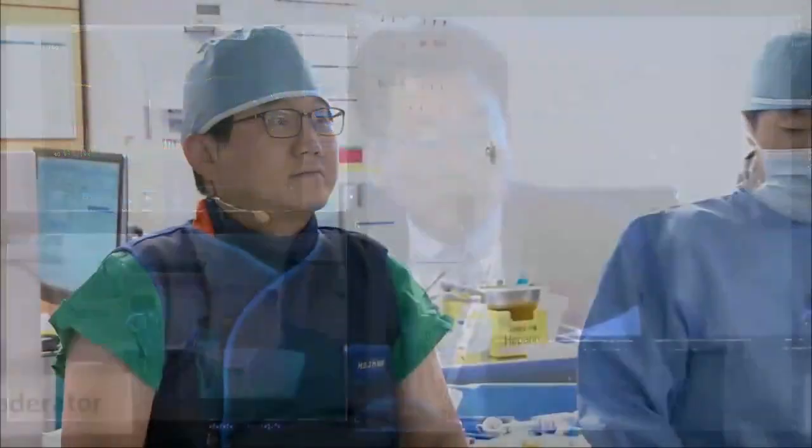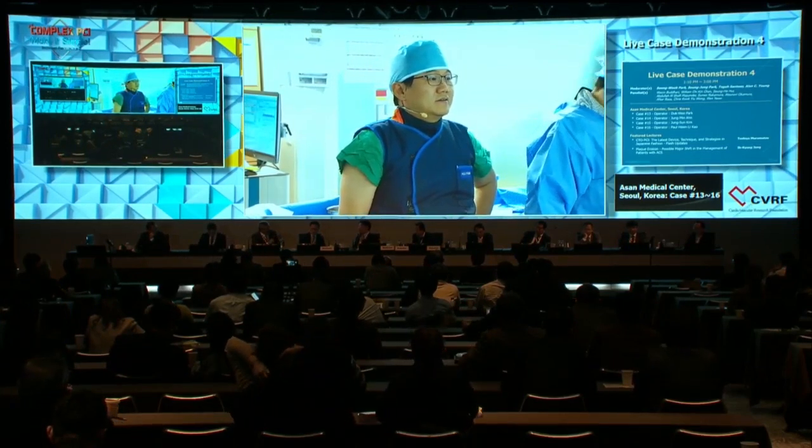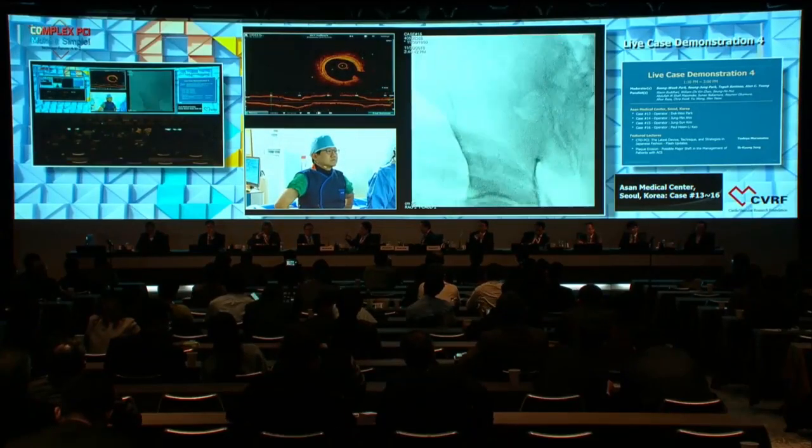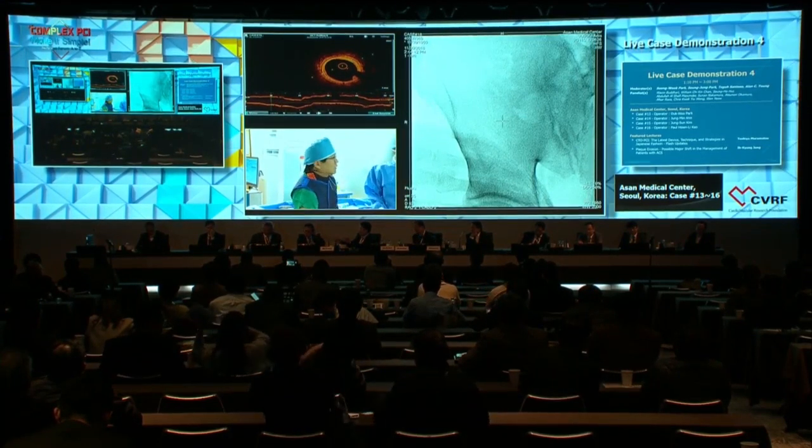Yes, that's definitely the lowest in-stent lumen size that I've seen with a normal FFR. 1.29, but still a normal FFR, which is amazing. Absolute minimal lumen area cannot predict function. There are lots of variables: lesion length, morphology, etc. So minimal lumen area is nothing. You see with your eyes a 1.29 luminal area, and we all would go up and stent or do something. I don't believe my eyes. So that's good. You believe in the number, right? The number is better.